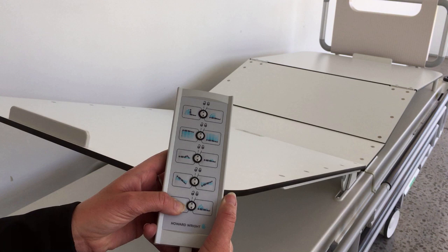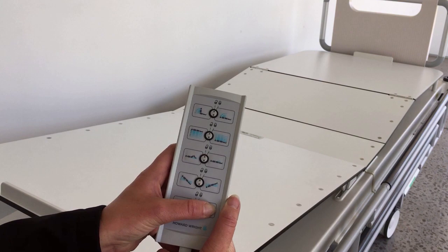To form a chair position, press the chair up button until a comfortable position is reached. To flatten, press the chair down button.